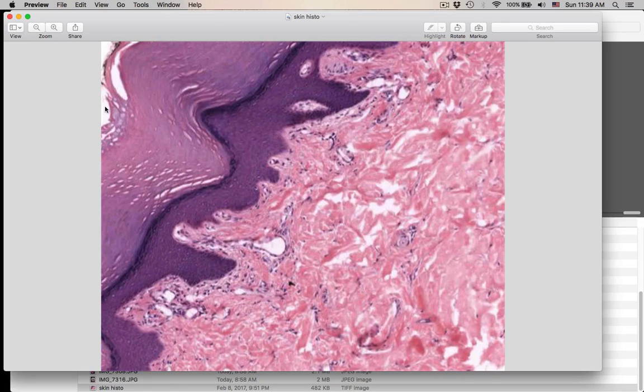Here's going to be the lumen up here. So you know this is your epithelial tissue. You should know where you are. You should know exactly what organ you're in. But what is the specific name for this darkly stained area? So that's number 32.